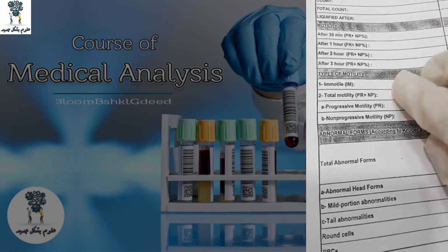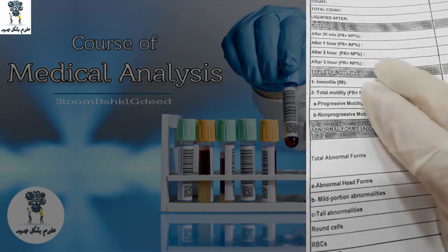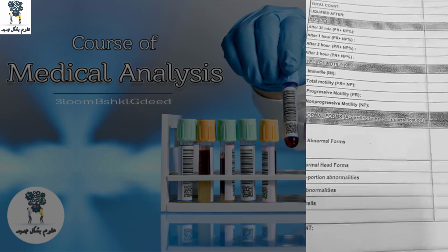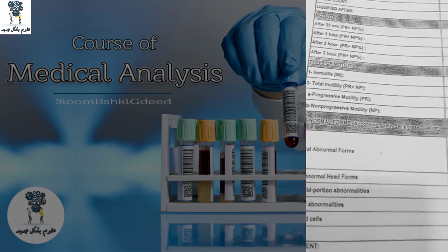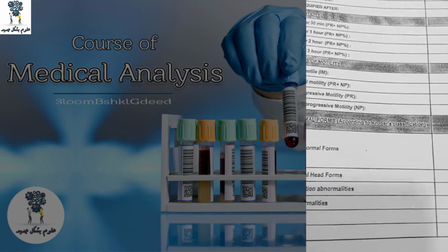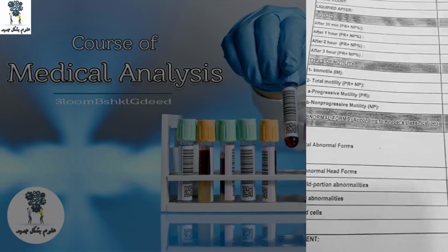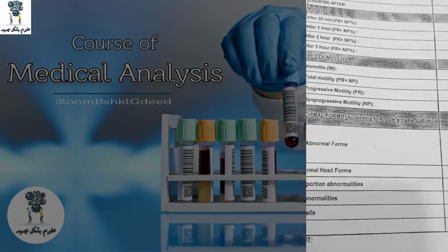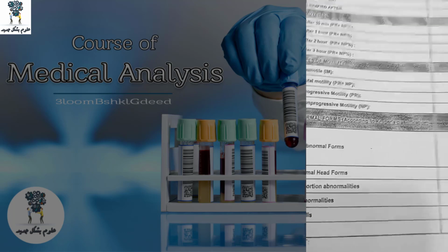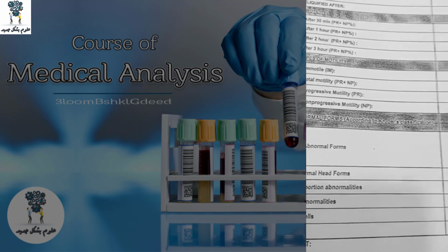ان احنا طبعا وصفنا وصف دقيق للسبرمات، قدرنا ان احنا نوصف الحركة، قدرنا ان احنا نشوف هي موتايل ولا اموتايل. وطبعا احنا شرحنا الكيسز لو هي اموتايل هنعمل ايه. طبعا احنا لو هي اموتايل خالص، ولا انا شاكك ان هي اموتايل مش قادرة اشوف بعمل الصبغة. طبعا في كيسز تانية احنا ممكن نكتبها في الريبورت واحنا شرحناها، اللي هي مفيش سبرمات خالص. طب انا شاكك هو في سبرم ولا مفيش سبرم، ساعات الاقي 1 ساعات الاقي 2 ساعات. اعمل ايه في الكيس دي؟ في الكيس دي هنقسمها، احنا قسمناها لثلاث محطات.